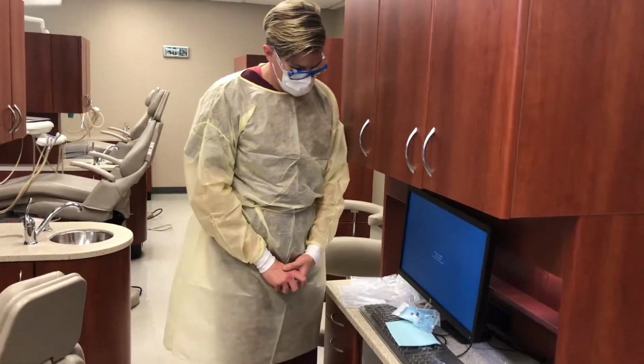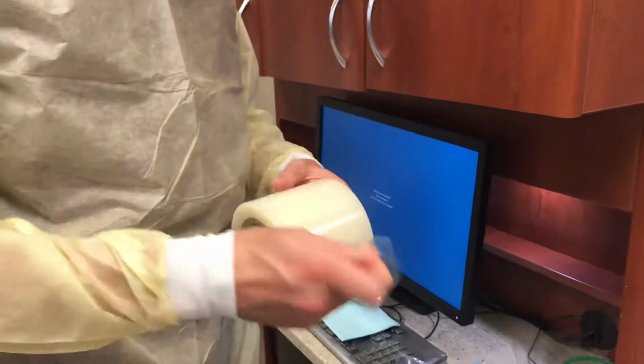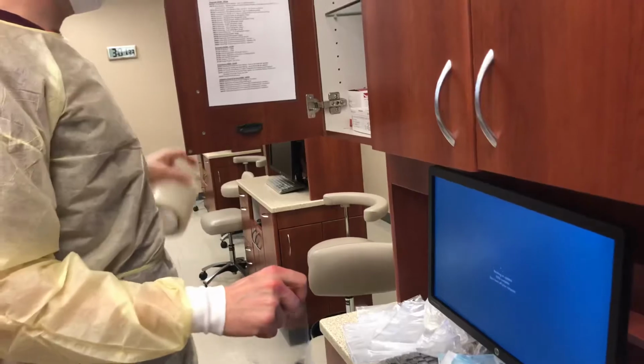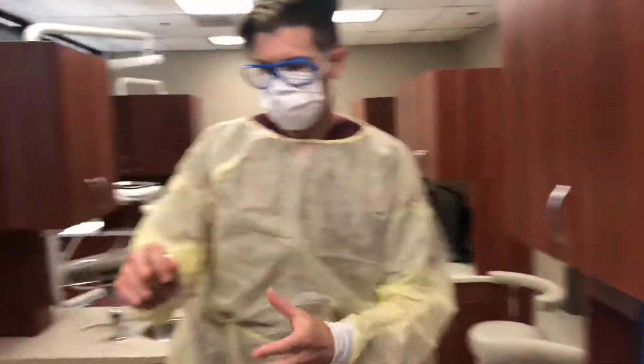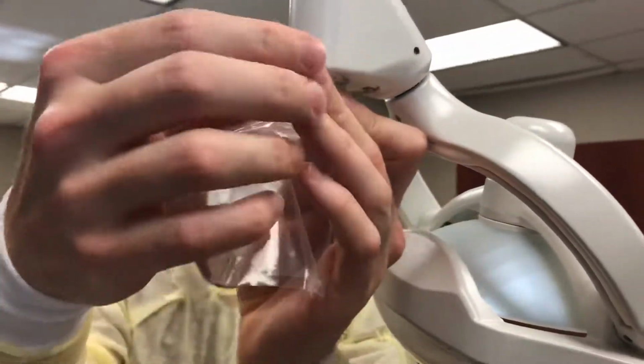Place coverall tape barrier on dental light switch. Hint, if corners of tape are folded down prior to securing it on, it will aid in removal. Folding the corners down.